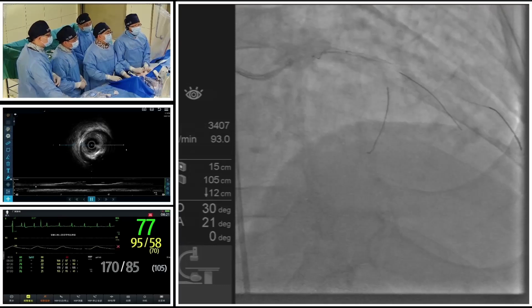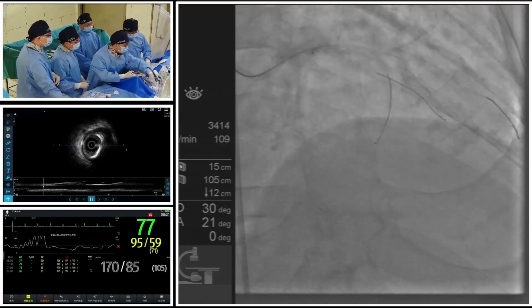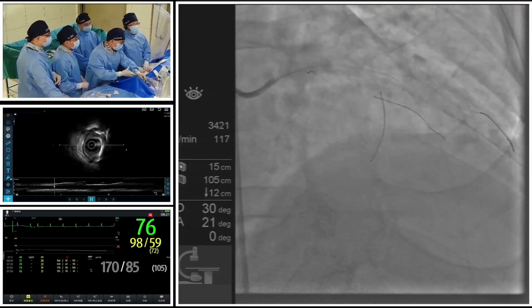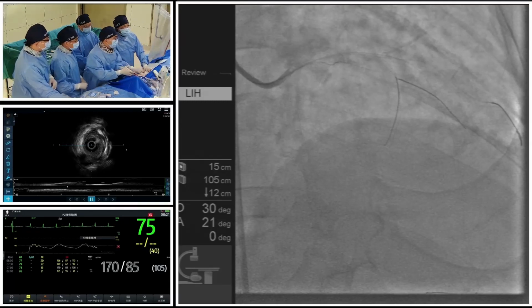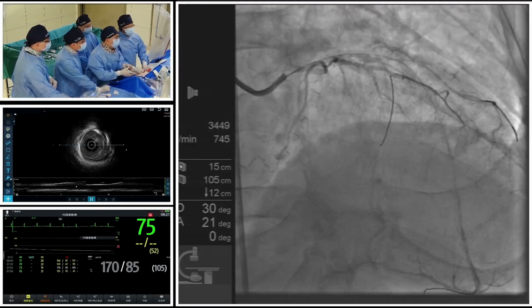Before we touch the patient, I think in this case, the 3D reconstruction, the intelligent visualization system helps us to give some detailed information with a very direct view to see the composition and also the calcified plaque distribution.